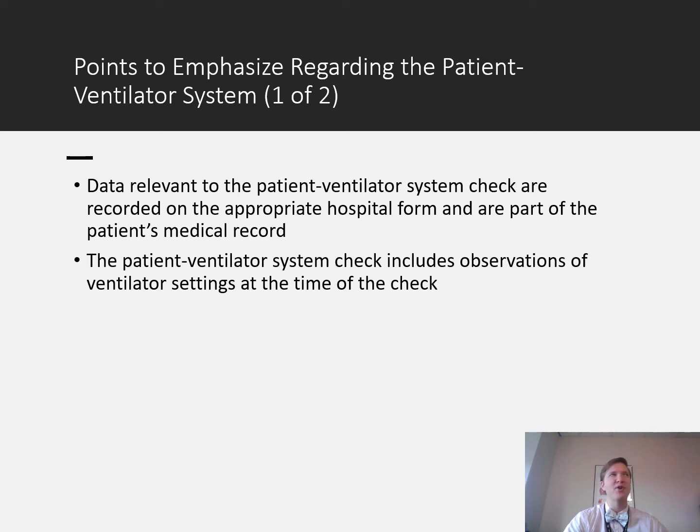So this is not for you to start writing your own novel. This is for you to paint a picture of what's going on between the patient and the ventilator and how that patient is looking currently, right? So make sure it's relevant to that patient ventilator check.